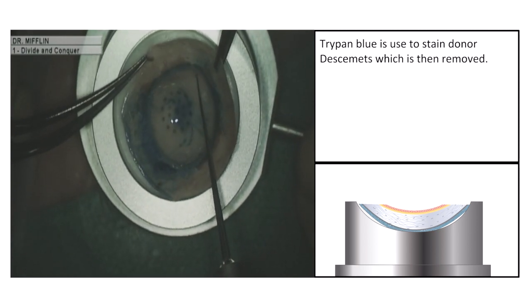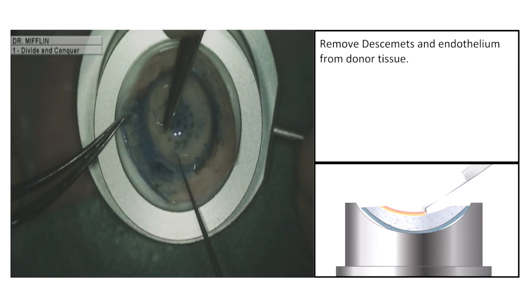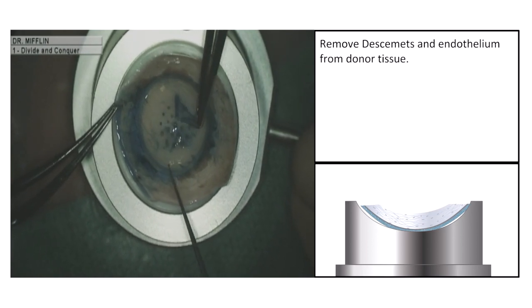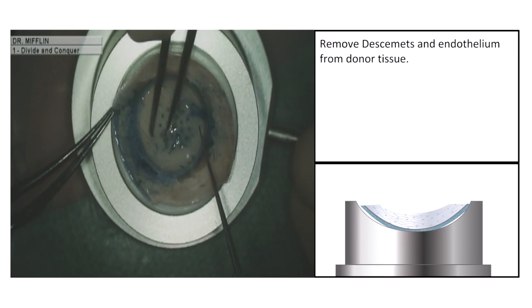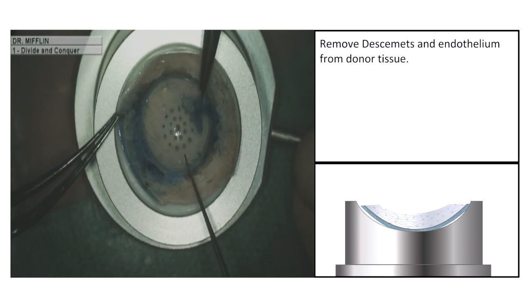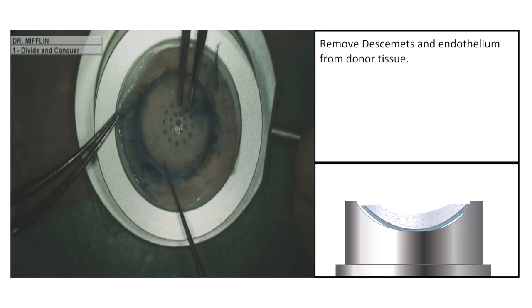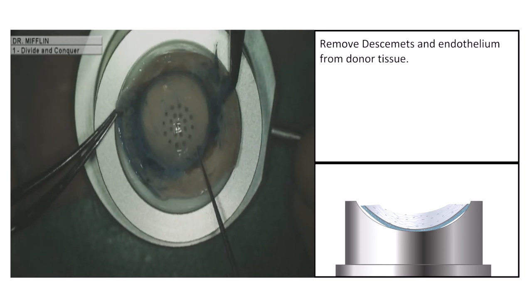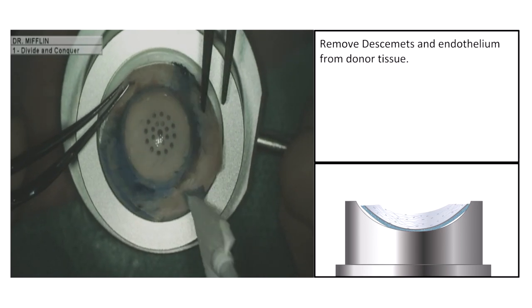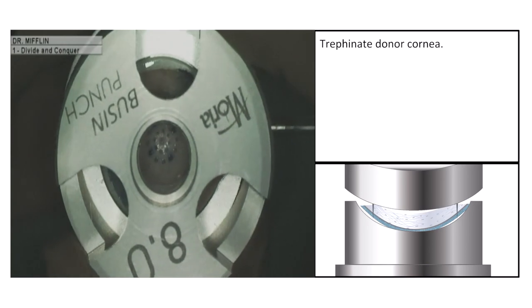Trypan blue is used to stain donor Descemet's membrane, which is then removed. Remove Descemet's membrane and endothelium from the donor tissue. Then trephinate the donor cornea.